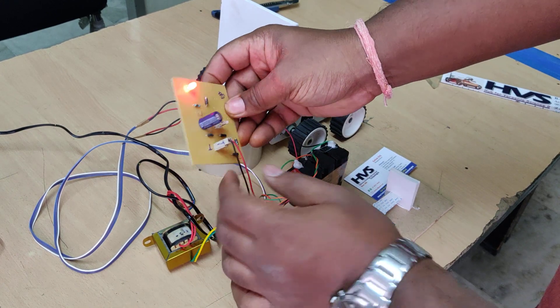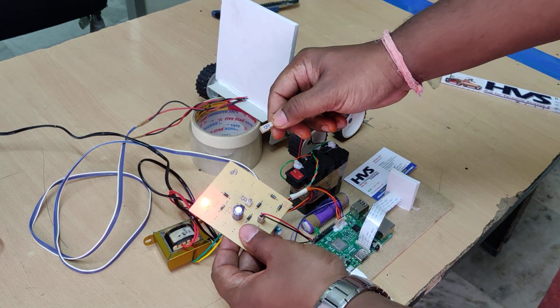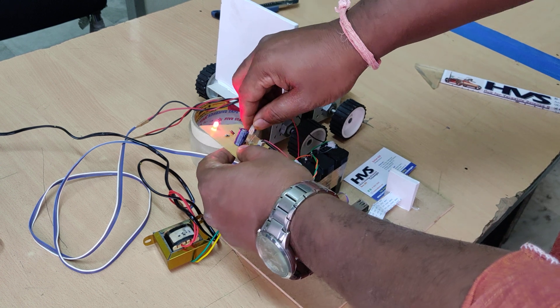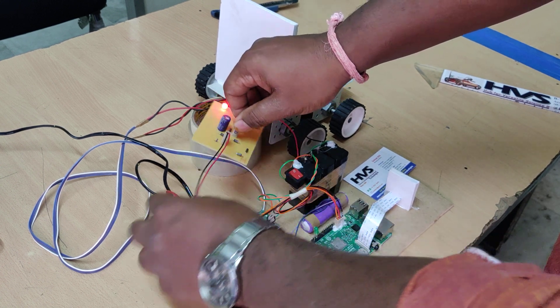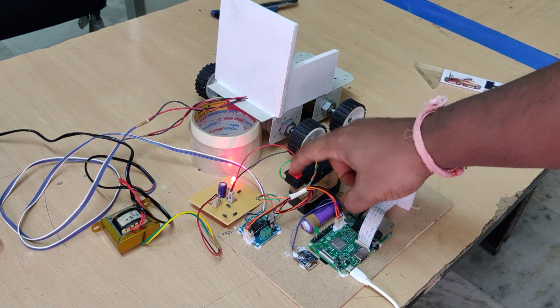Connect T to T and B to B for the charging connections. After making the connections it will take a minimum of eight hours to a maximum of ten hours to fully charge. Keep it on until then.